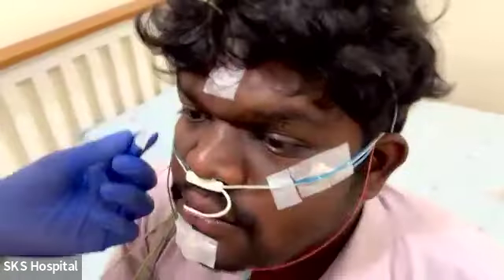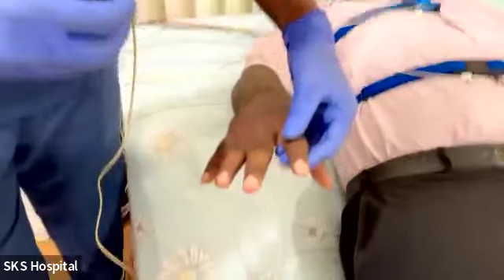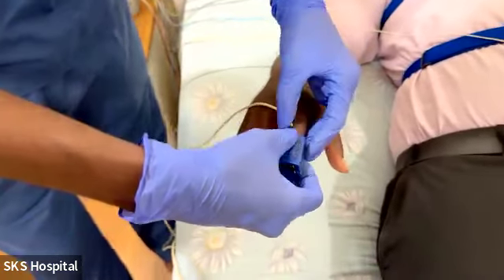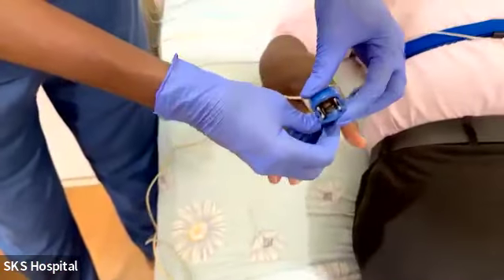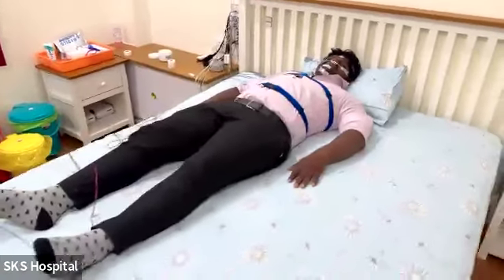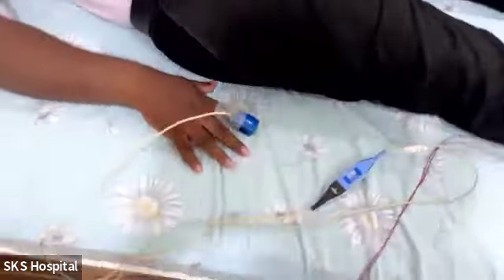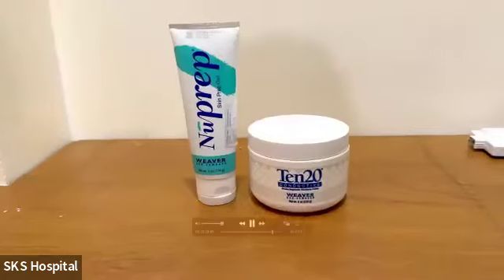This is just to fix the cannula's wires so that they don't slip away, because during the night the patient will be moving to left or right, so it shouldn't slip away. This is the SpO2 sensor. So the SpO2 sensor is connected, and this is how the connections go.